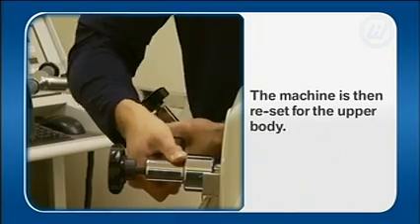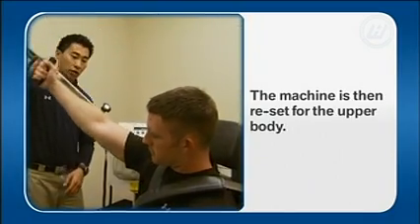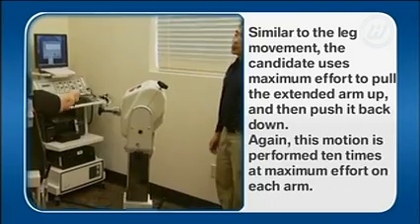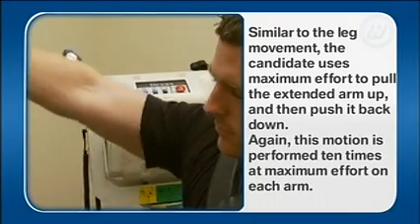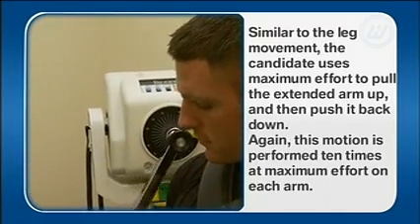The machine is then reset for the upper body. Similar to the leg movement, the candidate uses maximum effort to pull the extended arm up and then push it back down. This motion is performed ten times at maximum effort on each arm.